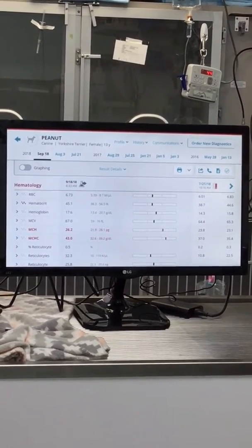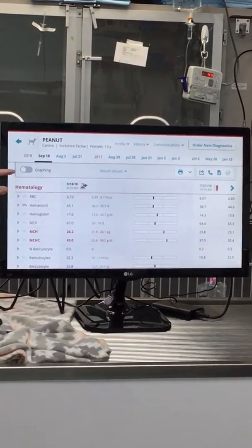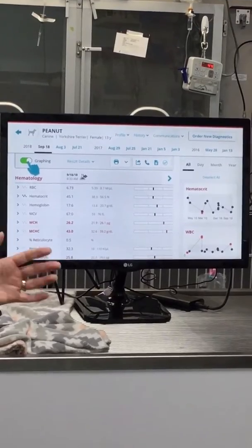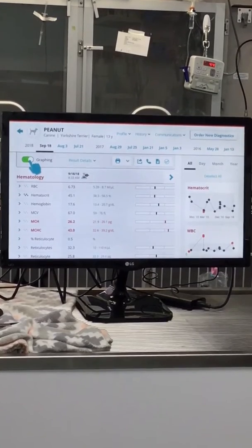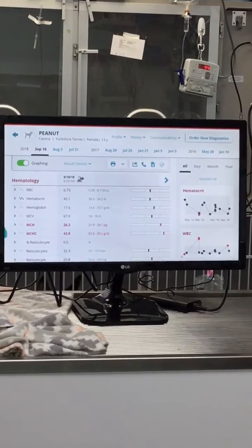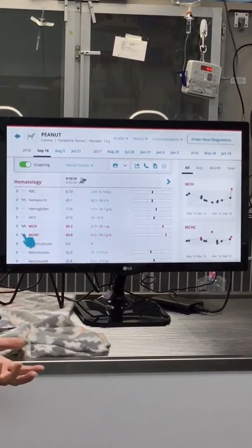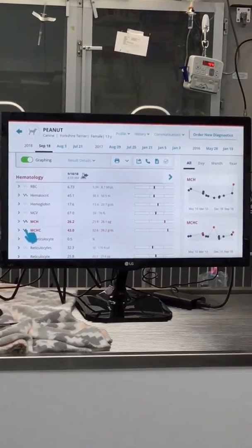All right. So obviously we've got some weird numbers here. The graphing is turned off. You can actually turn the graphing on, and it will actually graph certain things. Now you didn't have to pick and choose. It'll be the life of the pet. So as you can see, she's had a couple of times come in. If you were concerned about something specific, like this MCH and MCHC, you can click it and just select those. And it's just that simple. Anything you want to try just quickly comes up. And again, I know you don't do wellness, but I still think this might be beneficial with, like I said, your chemo patients that are coming in.